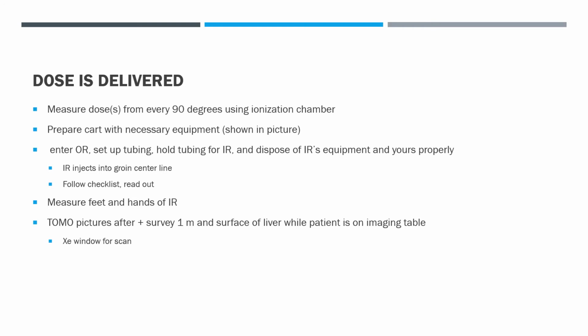And then after they do that, there's this cart that I'll show in the next picture that they use, that has basically this box, right? And it has all these kind of crevices inside of it, and then it has tubing, and one side of the tubing is for saline, because you'll be pushing about 50 mils of saline as you're pushing in the dose. You know what? Maybe I could show you guys the picture first and then go back. Hold on. I think that might be a little easier.